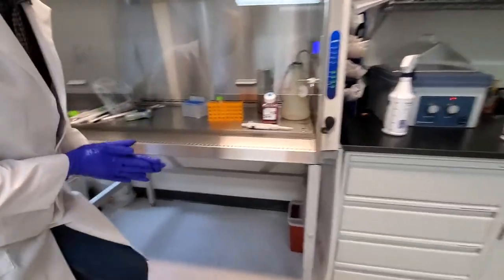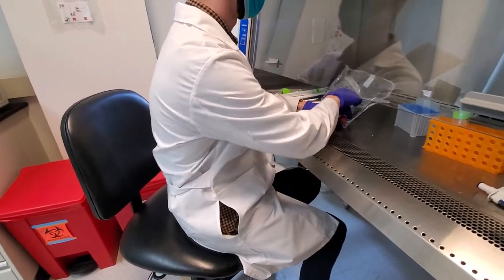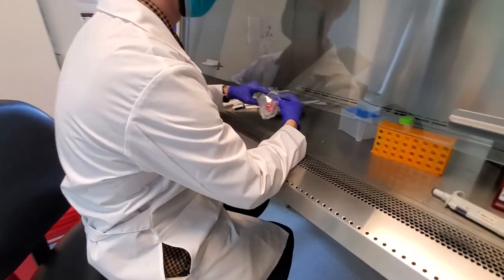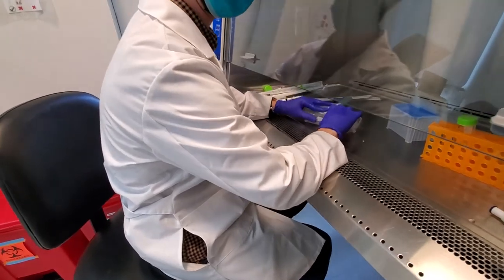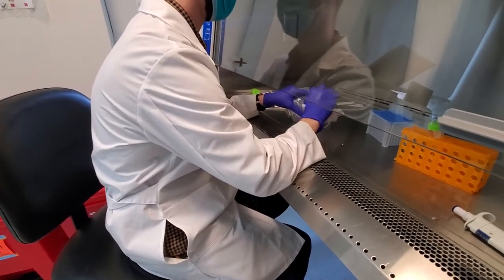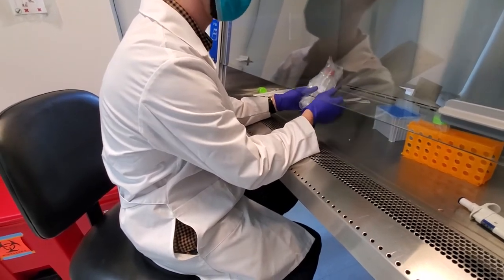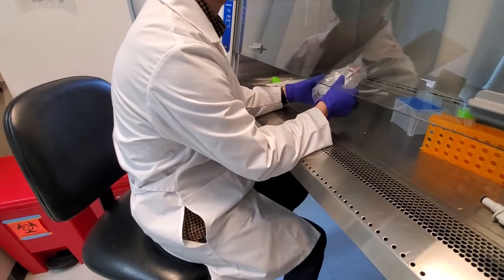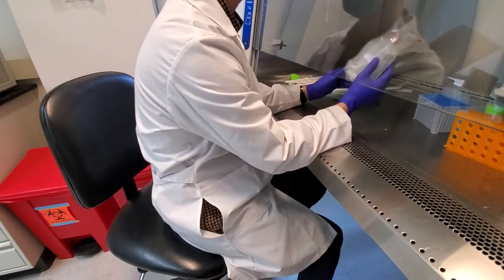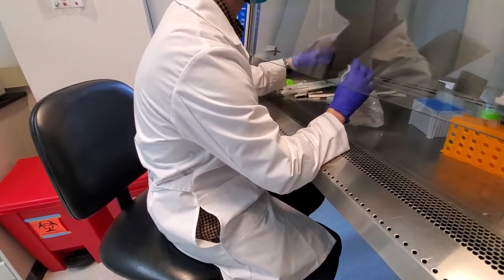But that's the idea. And then in terms of what to seed them at when you're passaging them, typically you can do a 1-10 or a 1-20 split. Depending on how many flasks you passage, you liberate the cells and pool them, diluting that volume by 1-10 or 1-20 and seeding again. When we get to that point, I can definitely go over that process with you and Herman too, just to confirm where the trypsin is and neutralizing and all that. So I'm just going to tape this back up so I can keep this as clean as possible.